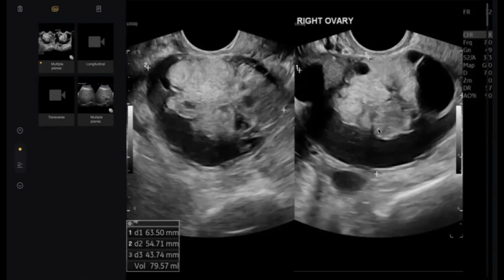Do you know? What is the general name of ovarian cancer? Cystic and solid like this. And the patient is not elder, just adult.